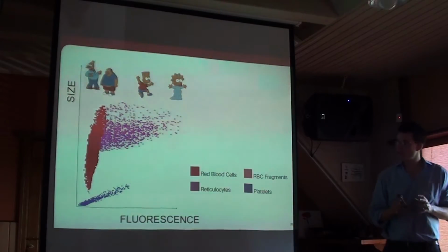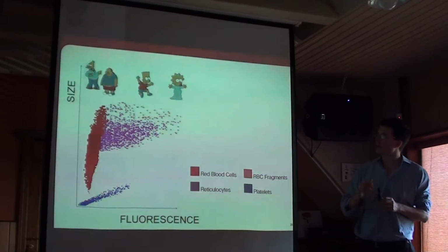So let us look at the red cell dot plot, similar to the one we were looking at earlier.